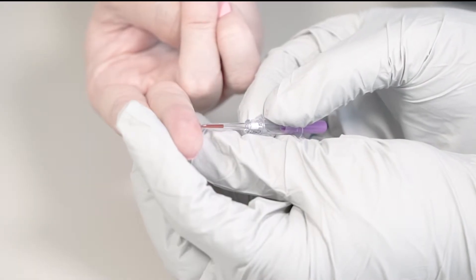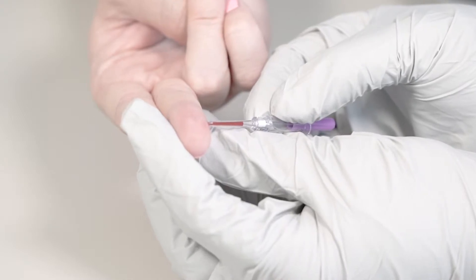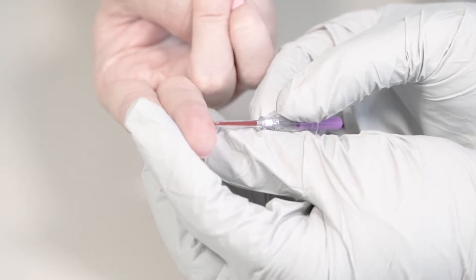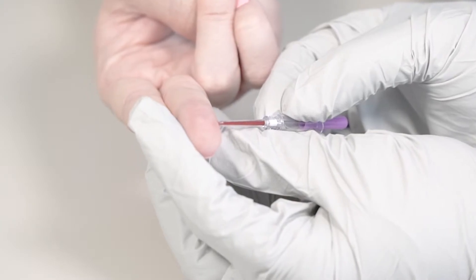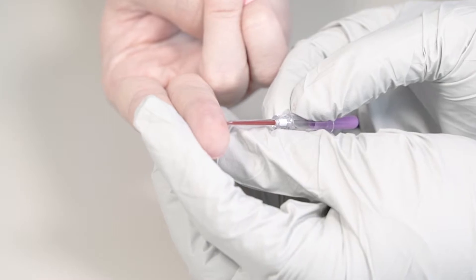Collect the blood from the finger prick into the collection device. Do not touch the plunger during the collection of the blood. Holding the device horizontal or slightly downward from the blood will allow the best collection. Continue to fill until the blood reaches the white stopper.